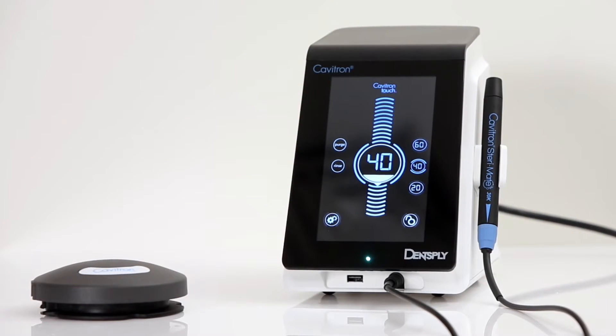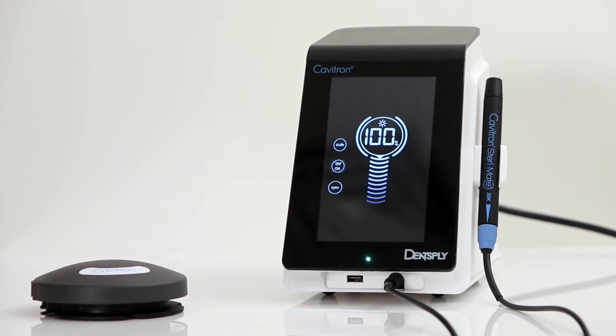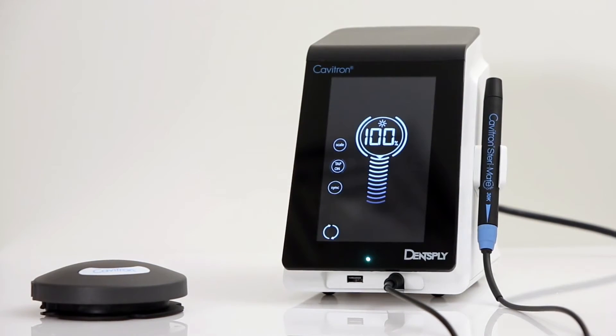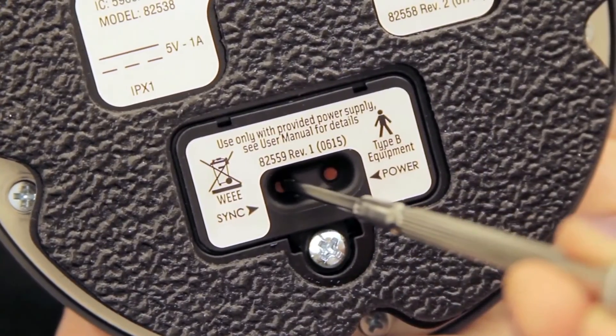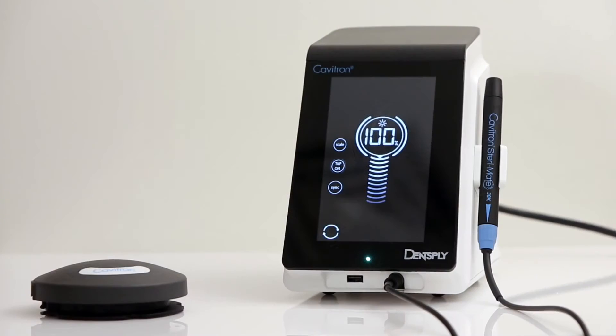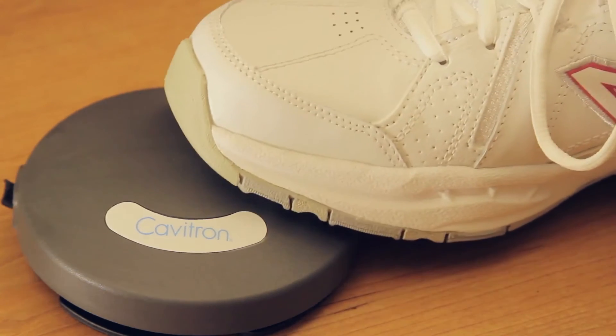This is also referred to as the scale screen. Please remove any inserts from the handpiece. Next, press and hold the settings icon until the settings screen appears. Press the sync icon on the settings screen, followed by pressing the red sync button on the bottom of the foot pedal and hold for at least 3 seconds. Synchronizing is complete once the sync icon has stopped rotating and sound indication occurs. In order to verify that there is proper communication, press the scale icon to return to the main screen. Press the foot pedal to the second position and ensure the boost is activated.